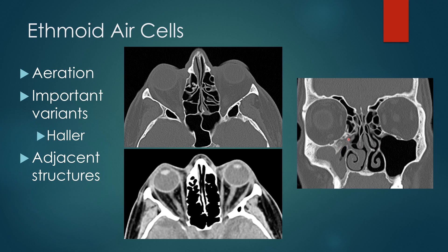On the right side there is obstruction of the osteomeatal complex. When you look at the ethmoid air cells, remember what's next to them — you have your orbit — and disease processes can affect either structure. You can have an ethmoid sinusitis that causes a periosteal abscess in the orbit, or you can have an orbital process that invades into the ethmoid air cells.